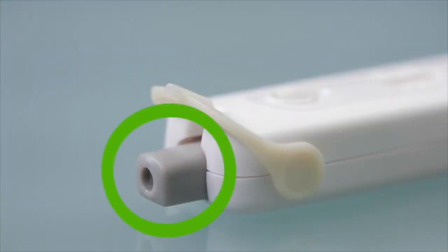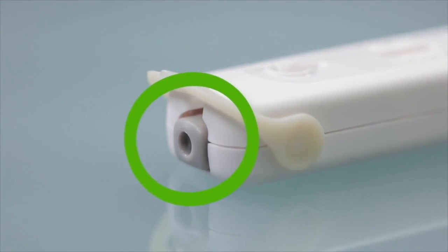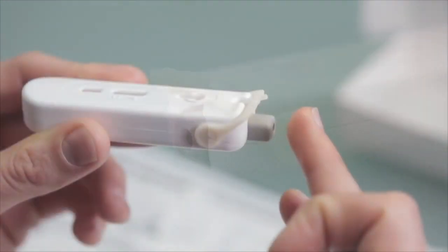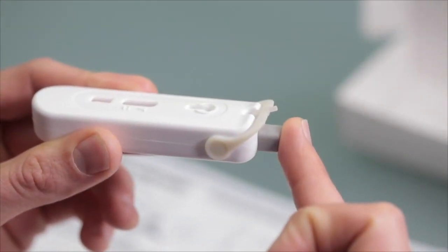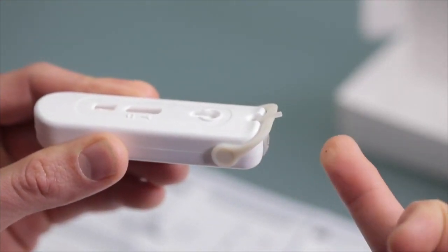The grey button is used to prick your finger. It can only be used once. It will look like this before you push on it. And it will retract after you prick your finger. Firmly push the grey button in to prick your finger. Remember, it only pricks once. Don't worry, to most people the prick feels like a rubber band snap against the skin.